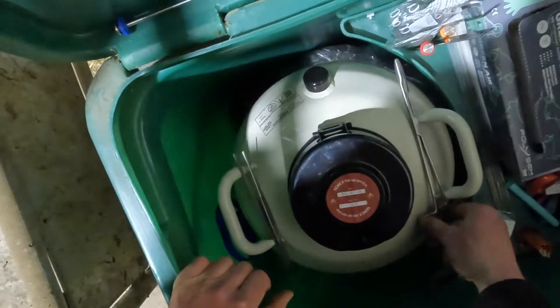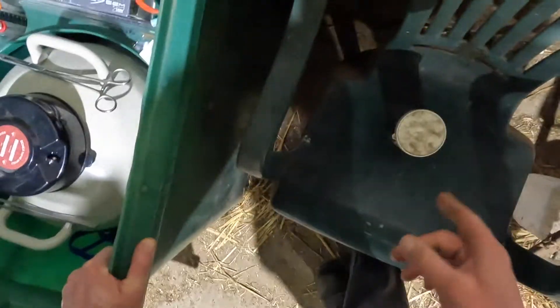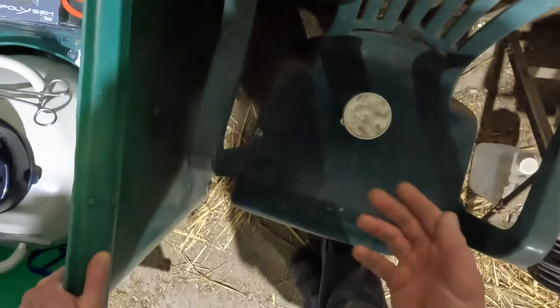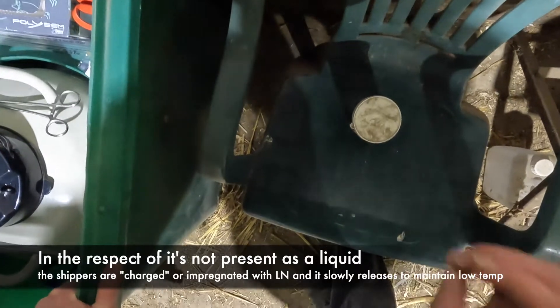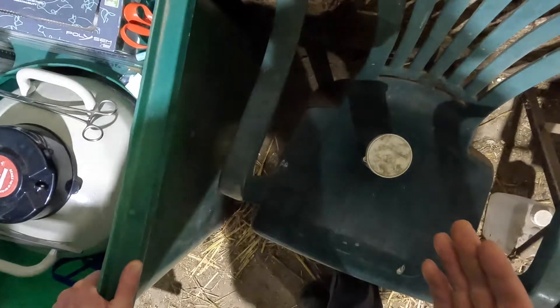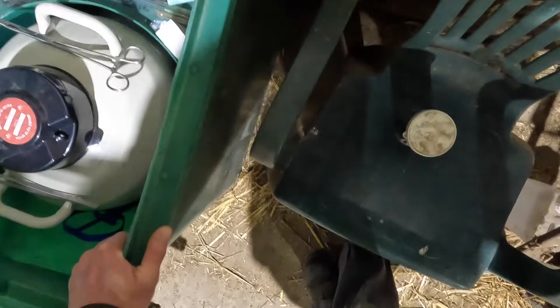Semen deliveries can be a bit of a daunting prospect. I've not got a cryo cube or a delivery flask here at the minute, so I've improvised with a bean tin and a lid. Your cryo cubes or vapor shippers, by virtue of the name, don't contain liquid nitrogen, so your stored semen in there is ever so slightly warmer than the liquid nitrogen in your flask. Bear in mind you've got a propensity for your straws to boil out of your canister because the temperature is different.